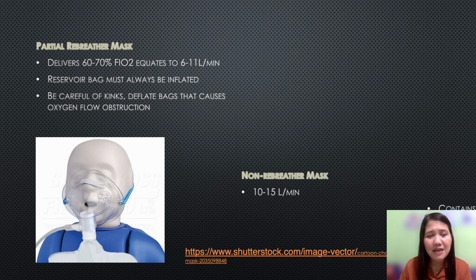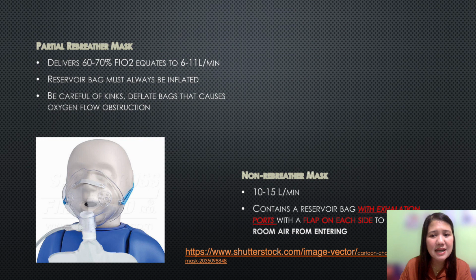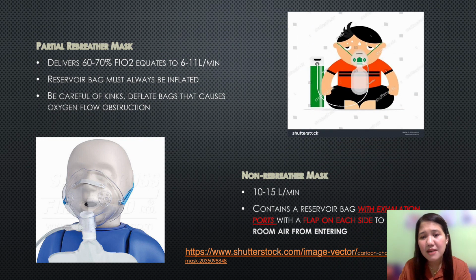Moving on, we have the non-rebreather mask, which delivers 10 to 15 liters of oxygen per minute. This mask covers the mouth and the nose with a reservoir bag and exhalation ports that have a flap over each port to prevent room air from entering that could dilute the oxygen concentration. That's why it's important to make sure that the ports are covered. This allows the patient to get the amount of oxygen needed from the reservoir bag. The non-rebreather mask delivers the highest oxygen from the category of oxygen delivery systems.